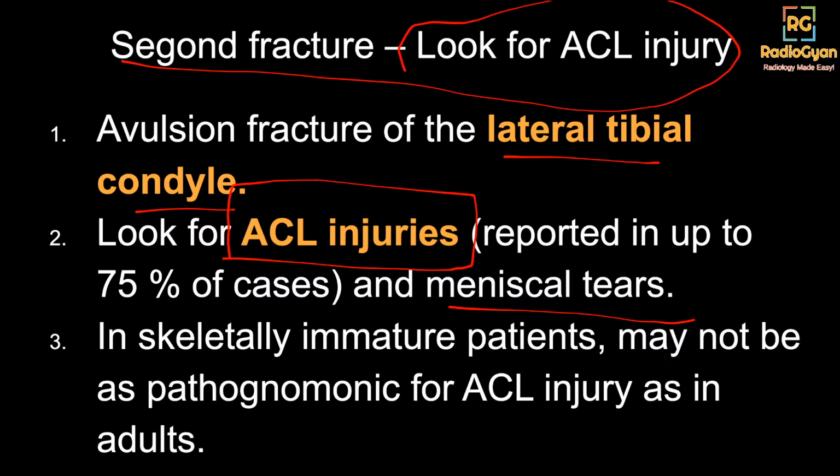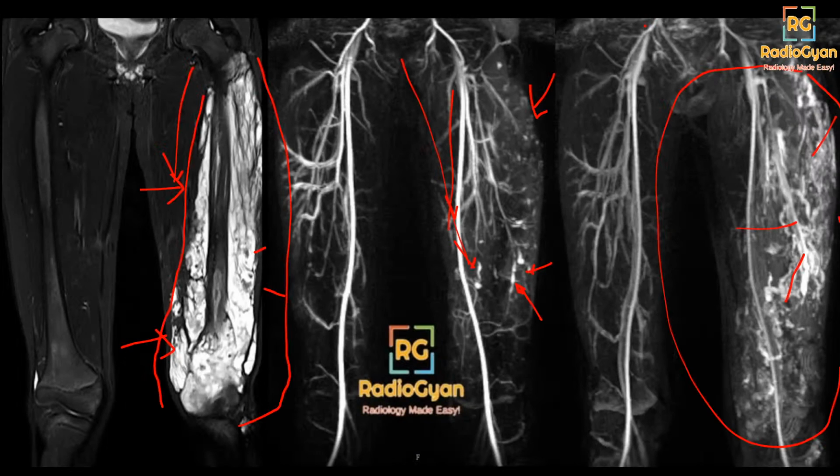So that's just an additional caveat. So Ayush had asked about the previous case, whether we can call it Klippel-Trenaunay-Weber syndrome, but I think it's a triad and usually a clinical syndrome. The additional imaging finding which we may see is localized gigantism. So for example, if you go to the case, both limbs were like okay, I don't see gigantism that much, so I would avoid that diagnosis.